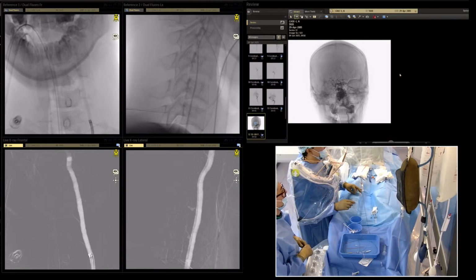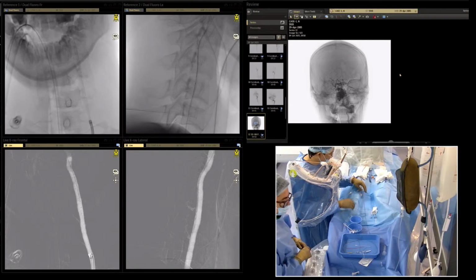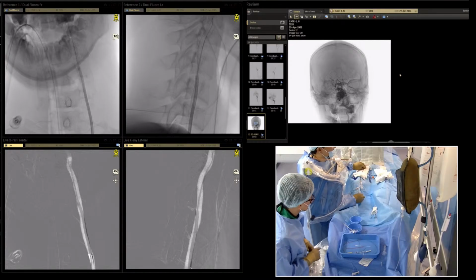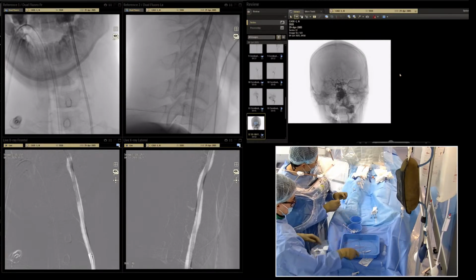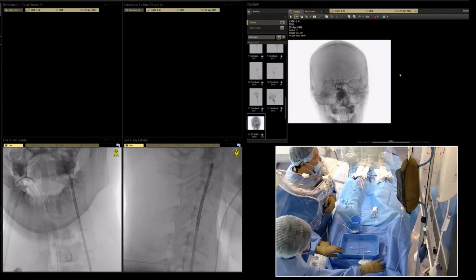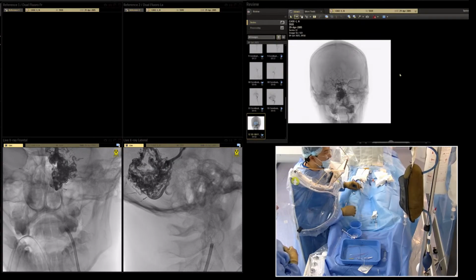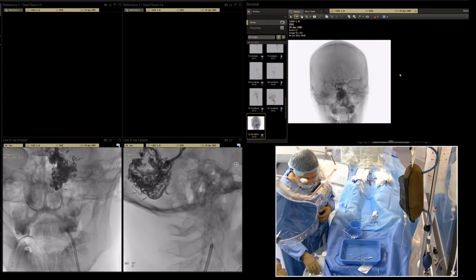Yes, first of all, I want to go to the posterior meningeal branch, and it will be safer for the patient to start with. Okay, we will take this out and put it here. And I think it's better to place the Sonic. It was some angulation.